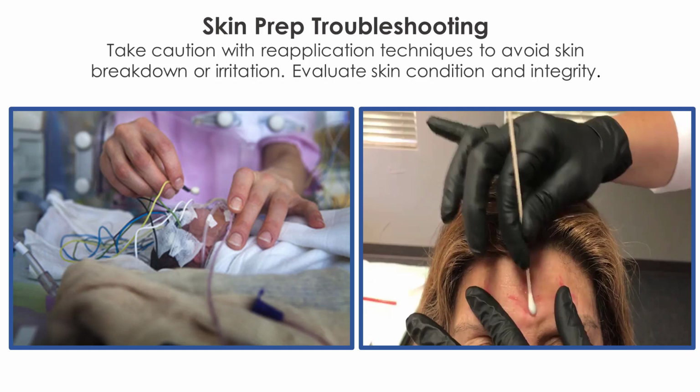Another suggestion would be to hold the skin to prevent any skin dragging as you are cleaning the area. This will reduce any unnecessary discomfort for the patient and increase the actual friction with the intended area. You can use the side of the cotton tip applicator with slight pressure and only rub the area that the electrode is being placed. If you're able to, you can practice on your forearm to have a better sense of how hard you need to press down on that area so it's not causing discomfort.